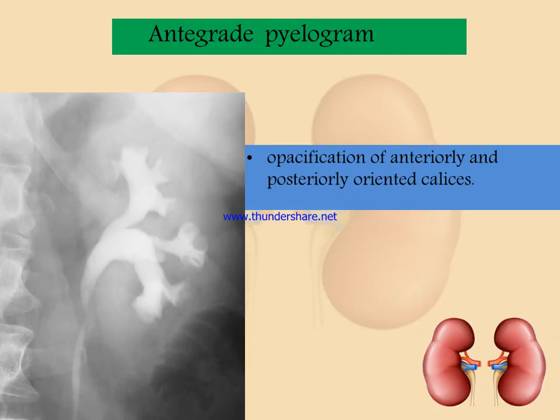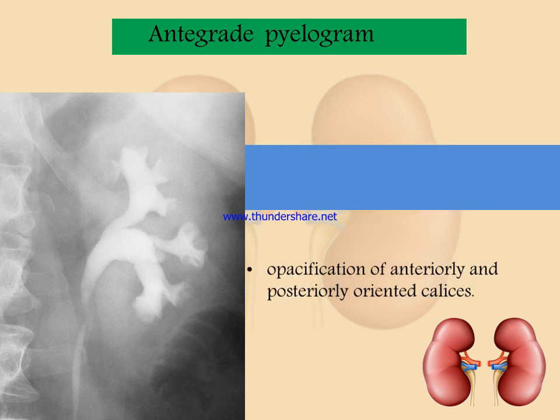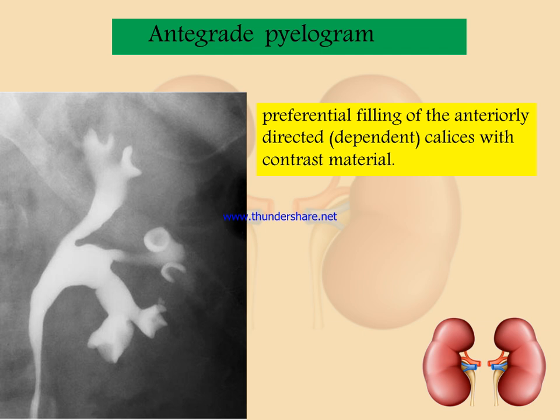The antegrade pyelogram is used for opacification of anterior and posterior oriented calyces, with preferential filling of the anteriorly directed calyx with contrast material. These images show these things.